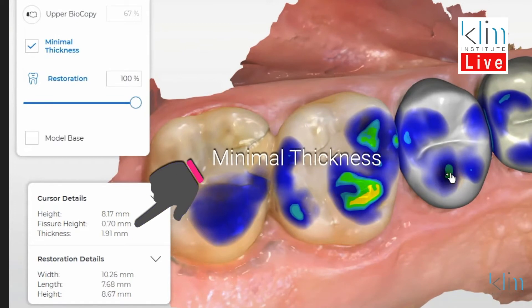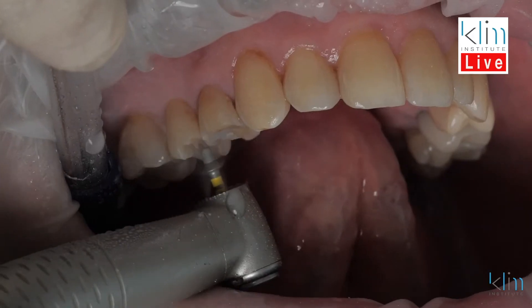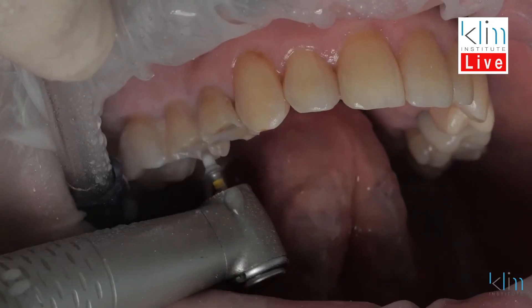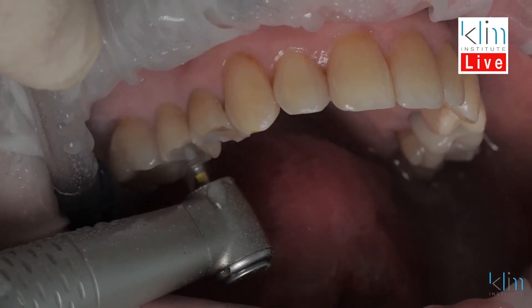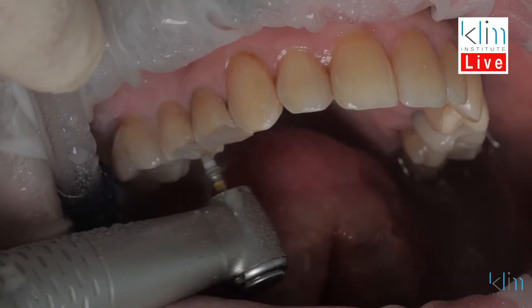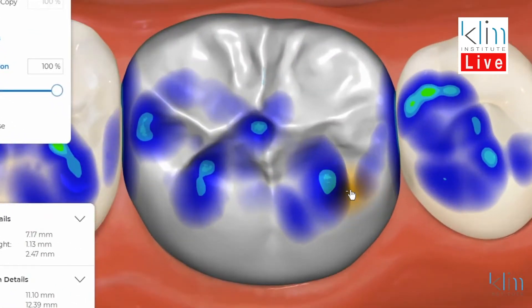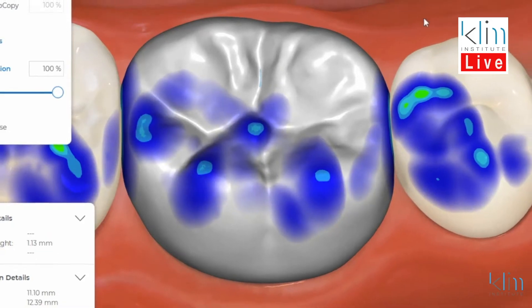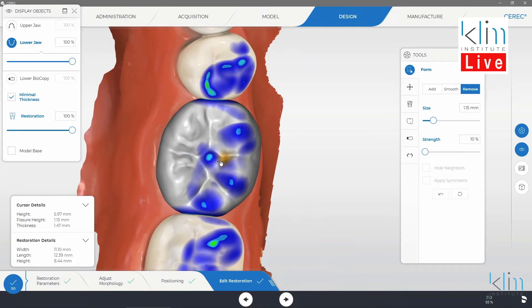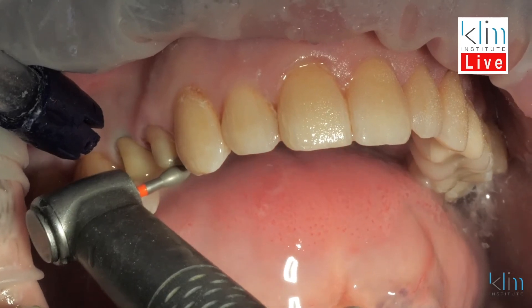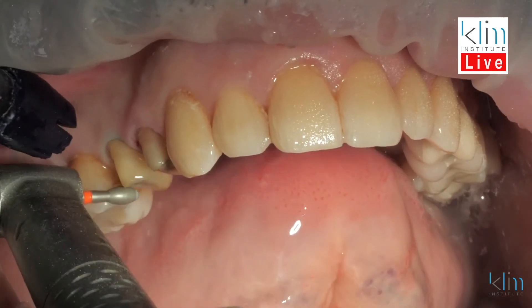One thing I like about the PrimeScan and CEREC is that once I'm in the design screen with the cursor details, I will see fairly quickly whether I have enough reduction. If I don't have enough reduction, I don't spend a lot of time with my tools trying to create a thicker occlusal table — because the proposing of biogeneric individual is profound. I'm all about morphology so we can control the occlusal surface for optimal function. If we need more reduction, just go back and reduce that area on the prep.